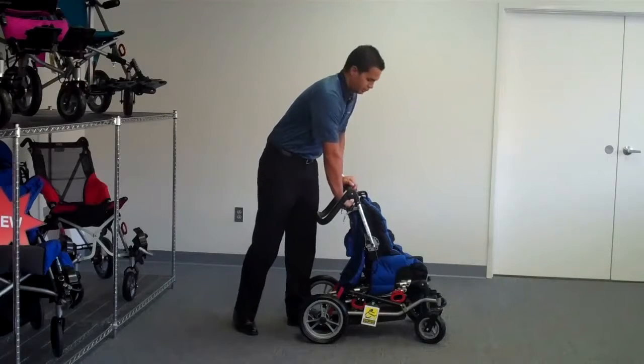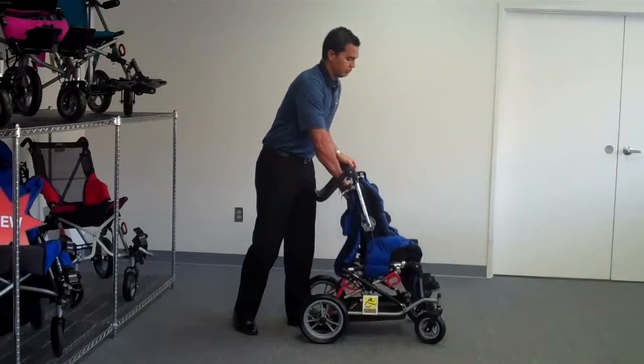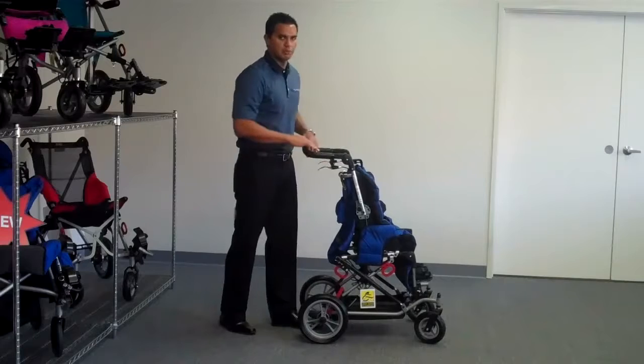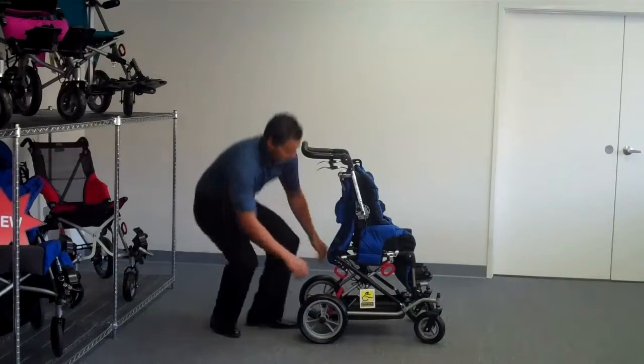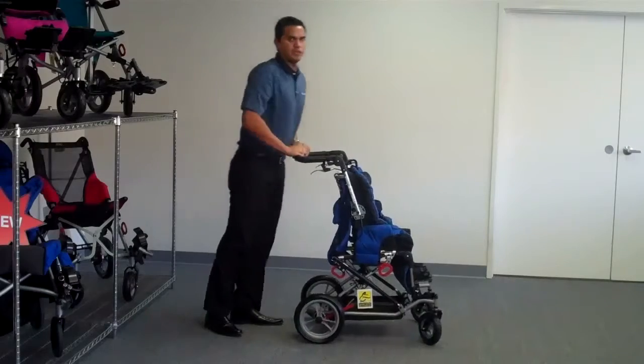To get your chair back to its highest position, simply pull on your high-low lever and the chair does it itself. To get your push handles back into position, operate your grade push handles, disengage your brakes, and you're on your way.